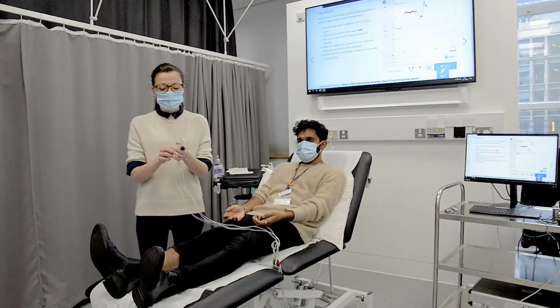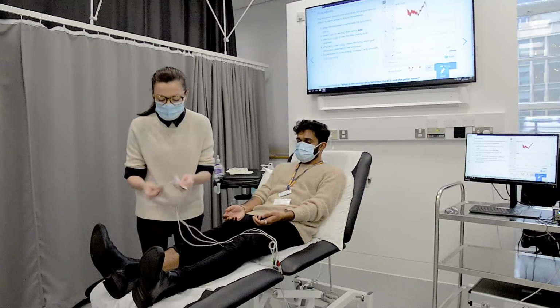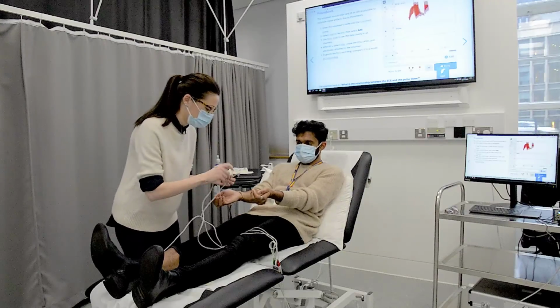So what we're going to do is we're going to stick some electrodes to Ash's skin. Is that okay, Ash? And we're going to capture an ECG. So we're going to place some on his ankle and then on his wrists.